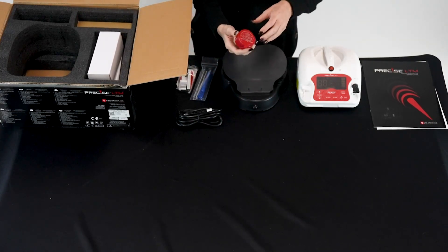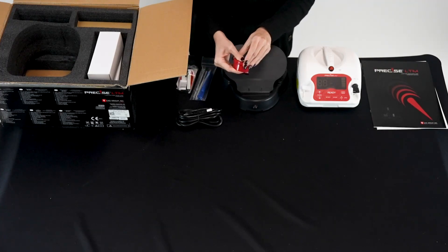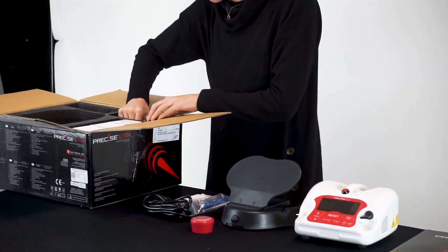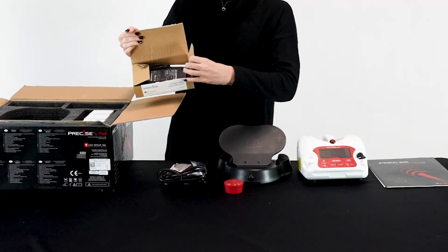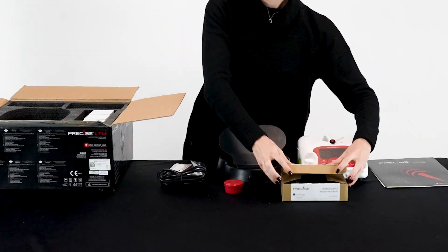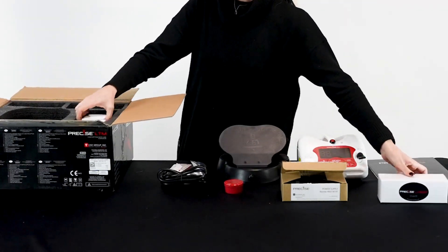One fiber stripper and cleaving tool kit, 20 straight disposable tips and 40 curved 60-degree disposable tips, one power supply, and three pairs of laser safety glasses.